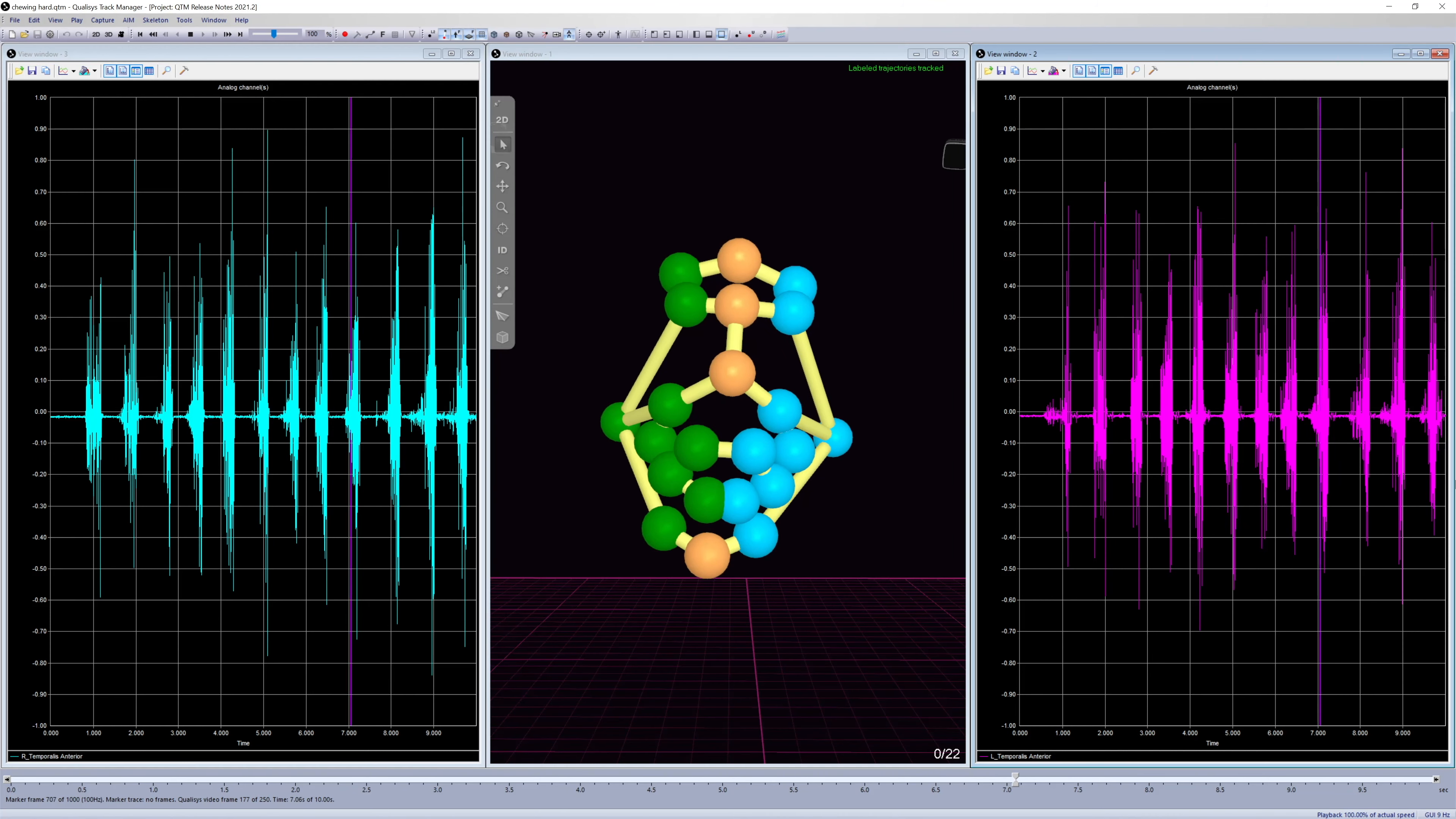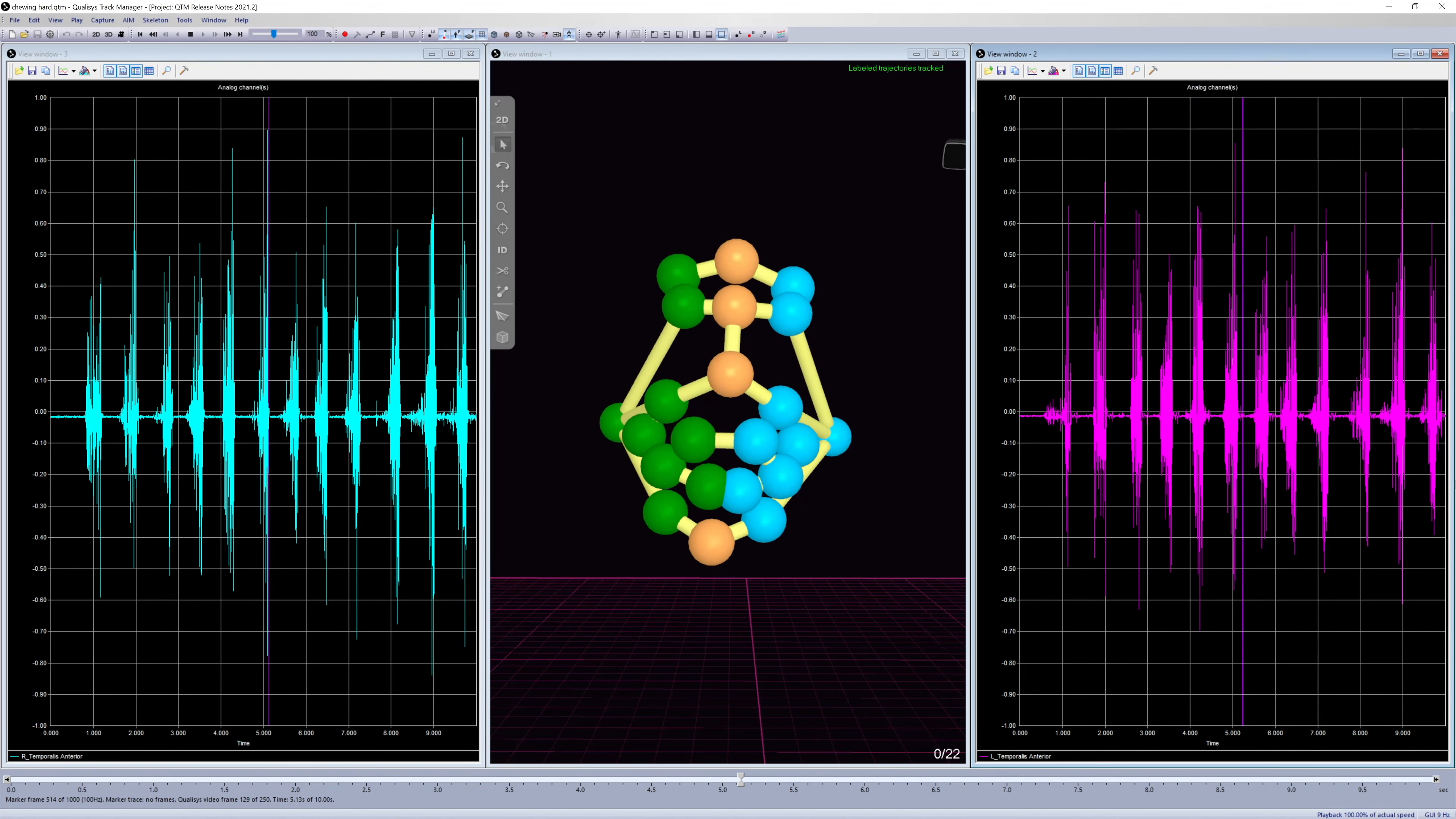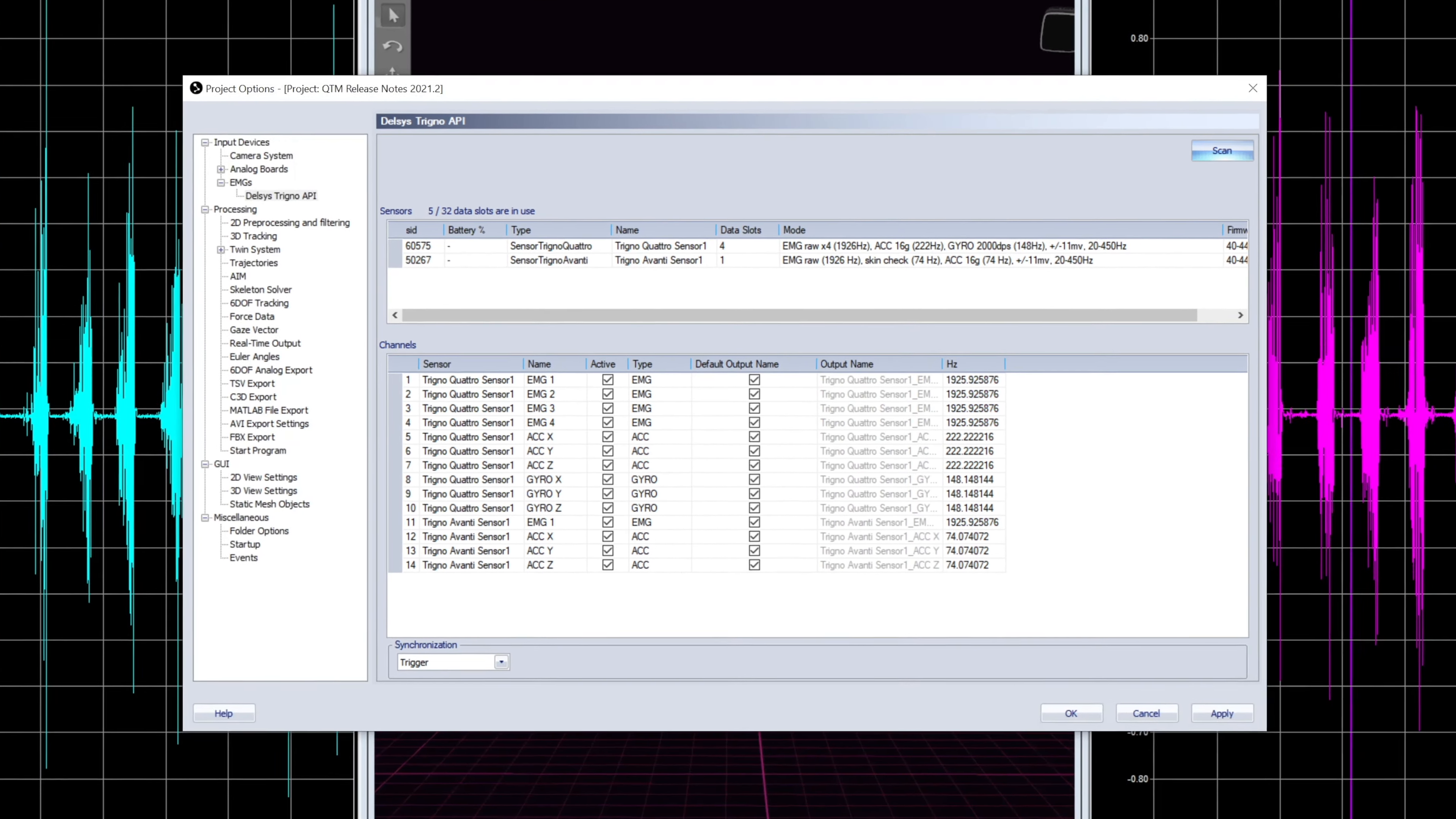QTM supports the new Delsys API in addition to the SDK, allowing for synchronization with a wide range of Delsys sensors, including the Quattro and the Duo. The API integration supports up to 32 data channels and includes an easy-to-use interface to manage your sensors and project options.